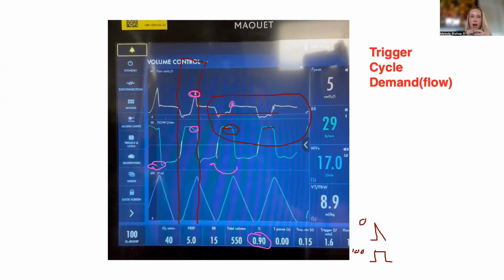So I think what I would try to do is get them into pressure support, probably at a pressure support of 10, let them have that rapid breath and see if they will start to slow down naturally with that support. And once I get them slightly more comfortable, then I would probably move to getting them back into a control mode, starting with pressure control, and then maybe if I need, going back to a volume mode once I get them settled. That would be kind of where I'll go to try to rapidly fix this as fast as I can.